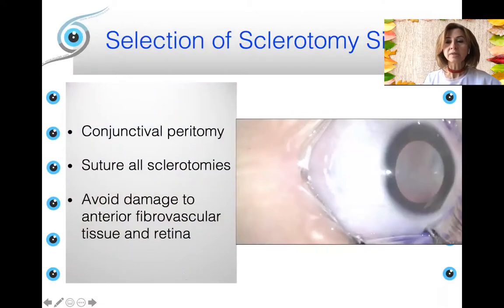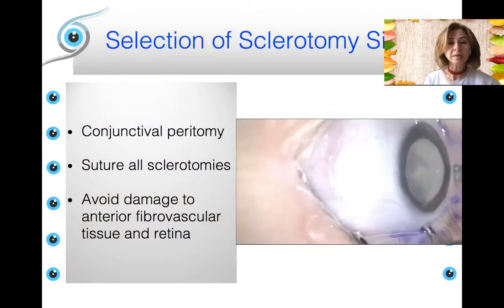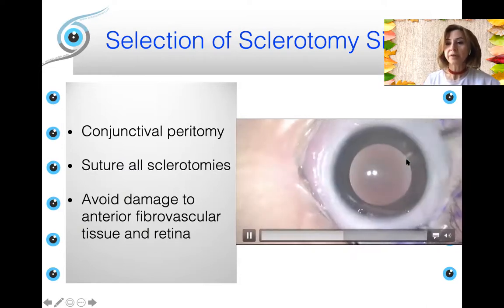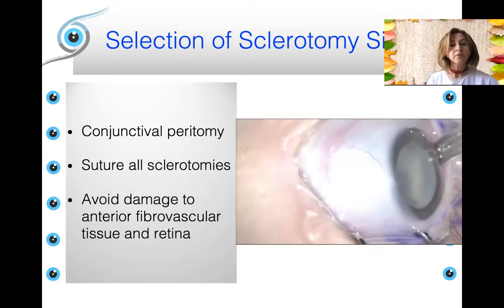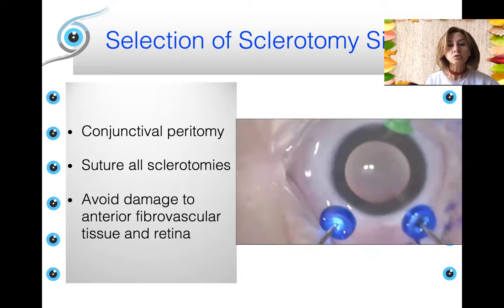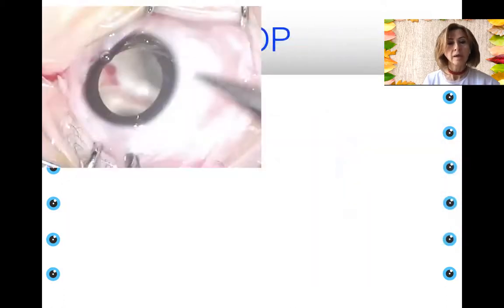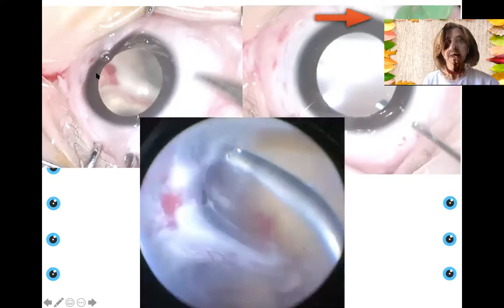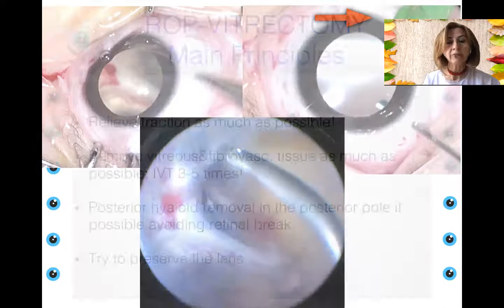The selection of the sclerotomy site is also a very important step in these cases, because you should avoid the area where the retina is directly into the peripheral pars plicata area. While doing the sclerotomy, you can cause a retinal break, and this may be a failure. So you should avoid that fibrovascular tissue. We always do conjunctival peritomy, and we always suture all the sclerotomies. You may even think about doing all nasal entries if the retina is totally in the temporal part. As you see here, we put the infusion cannula on the inferonasal side.